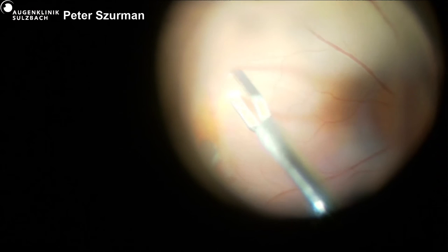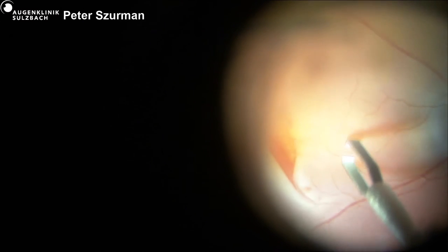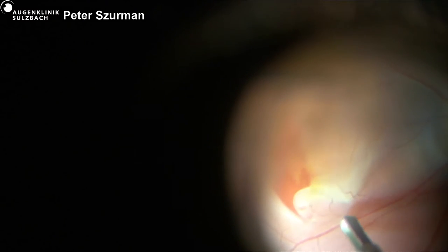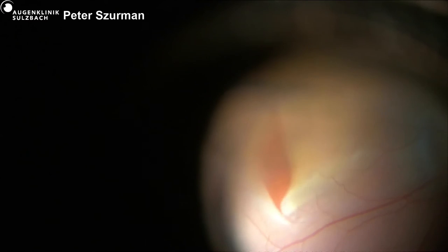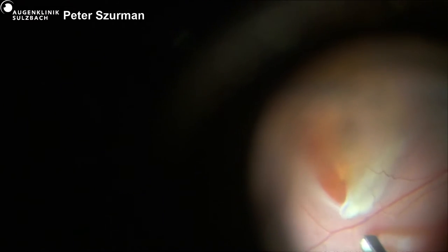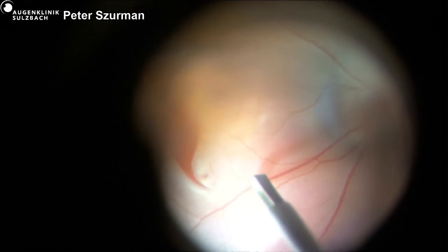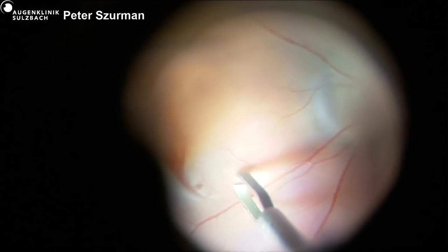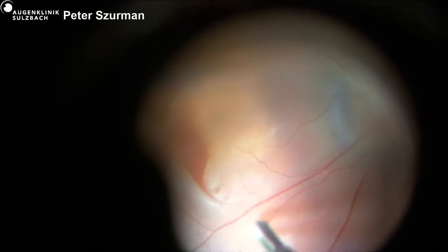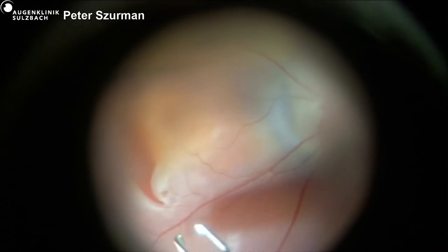That was the plan for the case. Which is better for the functional results, the ILM or the amniotic membrane patch? For the functional results, they are the same, because then it's not like the macular hole. For the macular hole, it has been shown that the ILM stuck inside the macular hole, even more the ILM harvested from the periphery of the arcades, can induce some alteration in the structure of the retinal layers. The amniotic membrane seems to regenerate some layers of the retina, even more the more external ones.